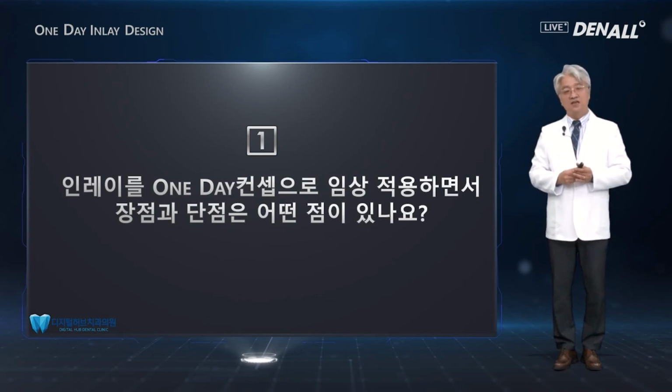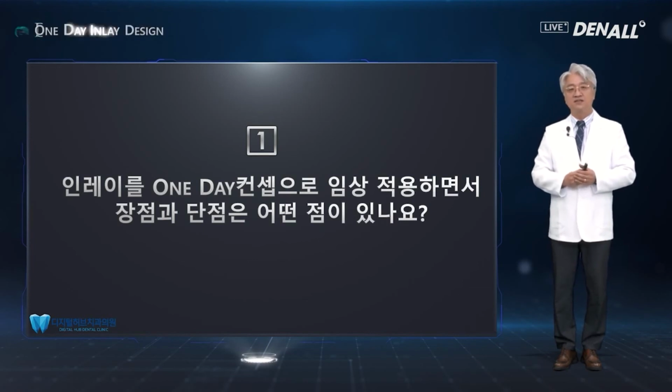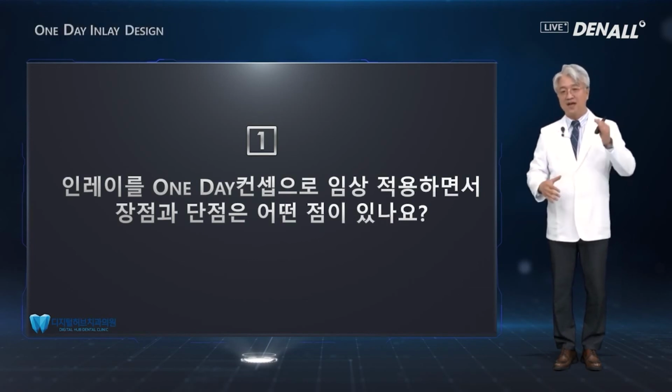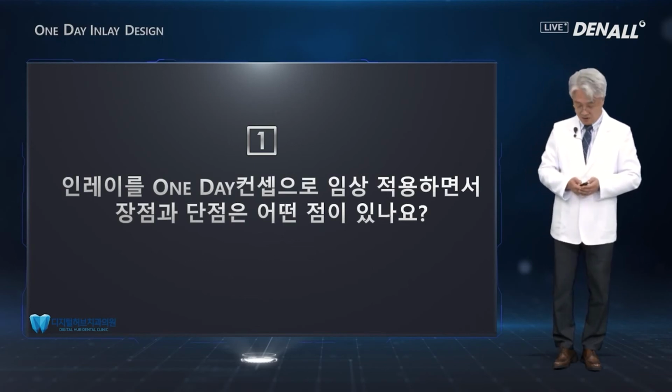But I believe that if you seek the support of a digital dental lab, then you need only an oral scanner at your clinic to do the one-day inlay approach. So there are many more advantages than disadvantages in the one-day concept.